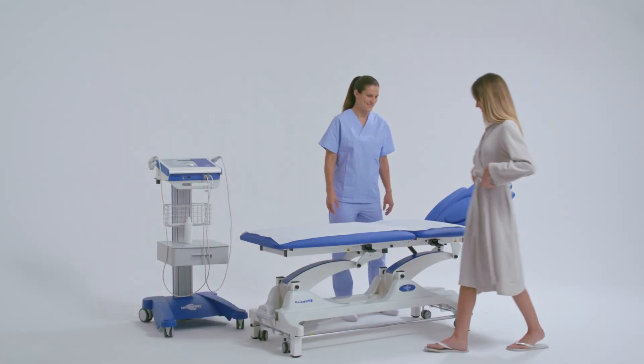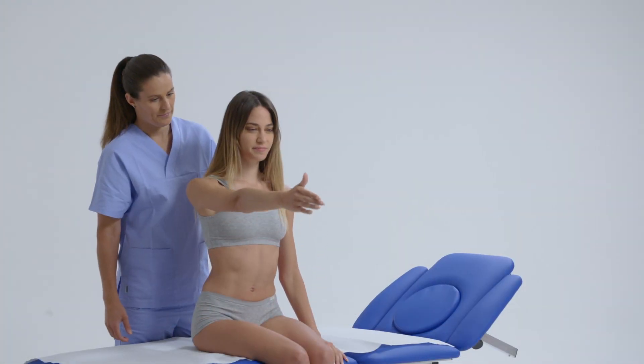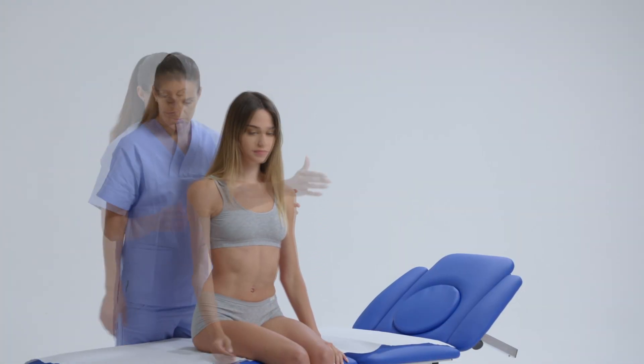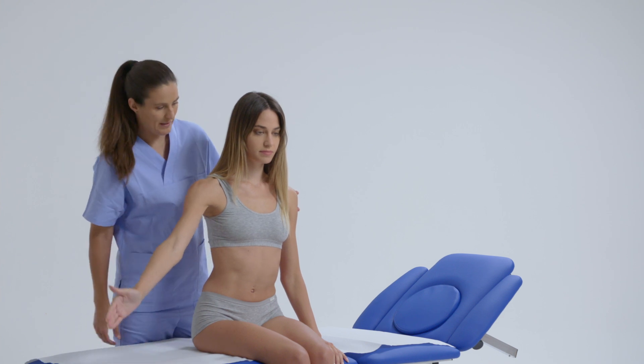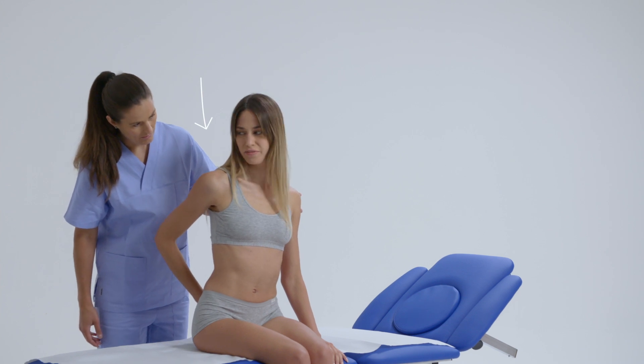This video will show the use of the Kinesport Sonic 2 ultrasound device to treat frozen shoulder quickly and effectively. After assessing the patient's pathology and symptoms, the pain area to be treated is determined.